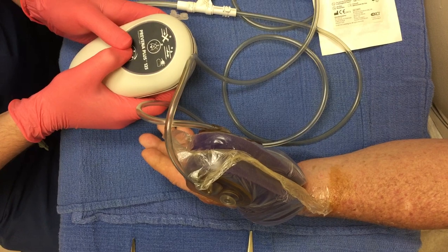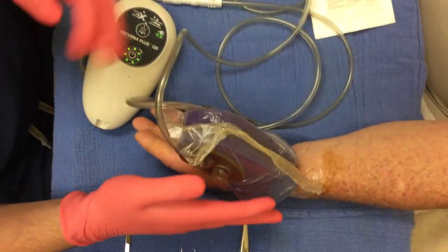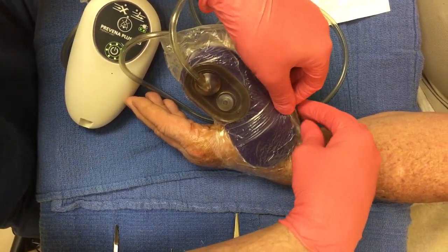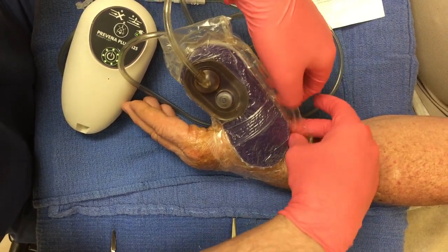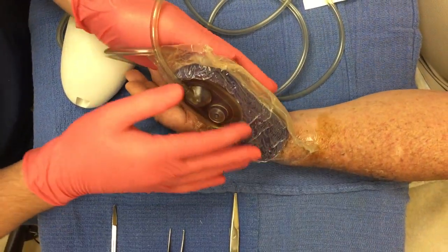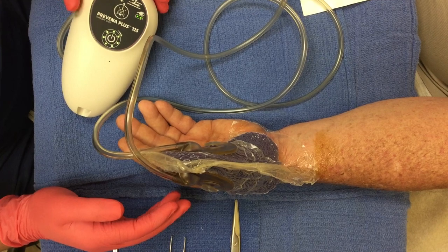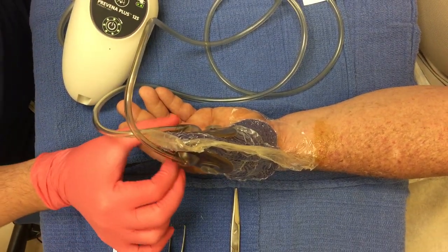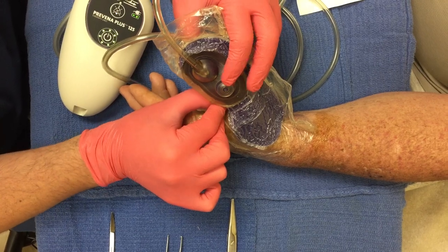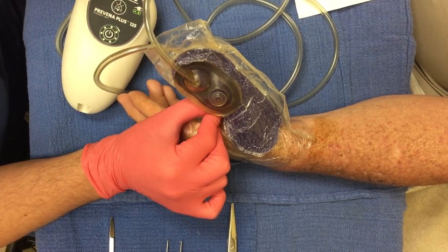Here's the power button — we hold it down until the green light turns on. That's the pump going on. Then if we look over here, you want to make sure that your seals are good, and that the sandwich — because this is the sandwich you can see — is meeting and touching the backside. You can see it's starting to get hard and it shrinks down. Also if you listen to the pump, it's going to make less sound and then it should stop making that sound, and then we'll know that we got a good seal. So that's good — we know we got a good seal.